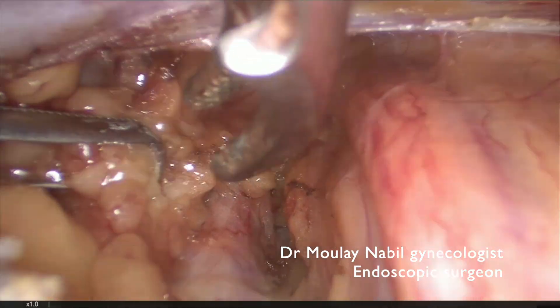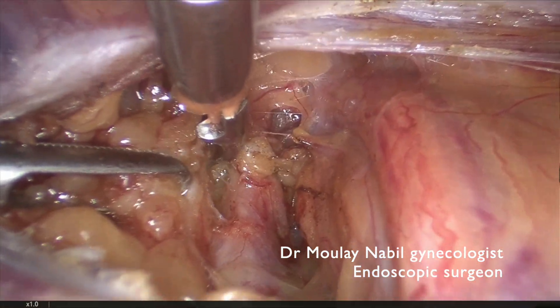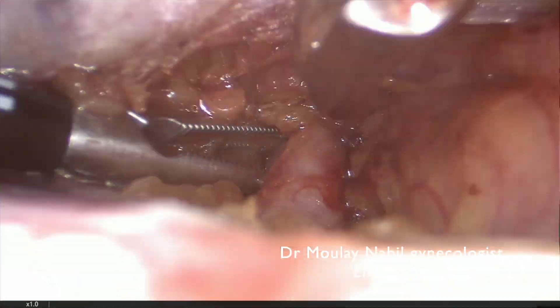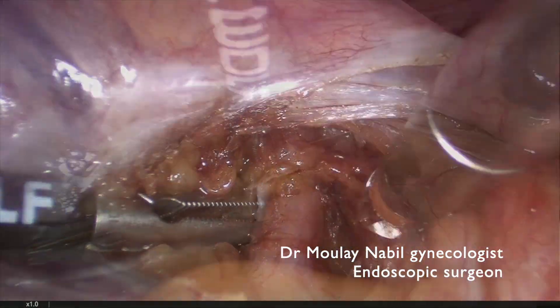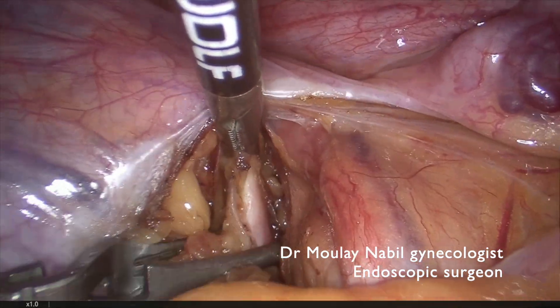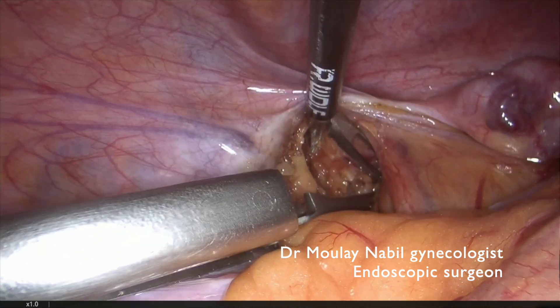We have to remove the fatty tissue surrounding this artery by a simple movement of traction and counter-traction. We can reach this artery and place the bulldog in the same manner as we did on the opposite side.